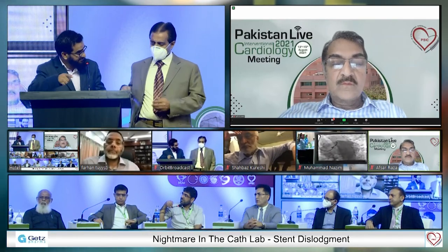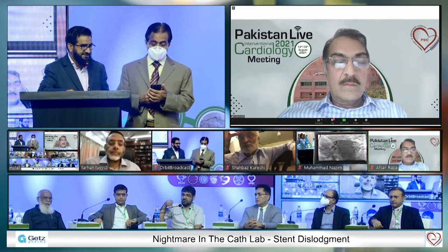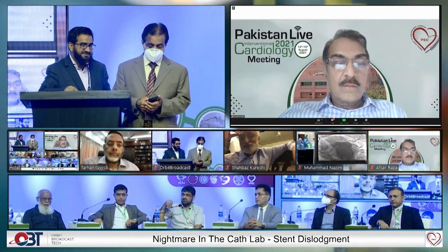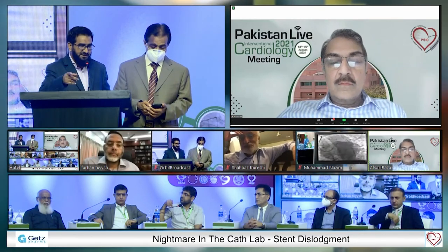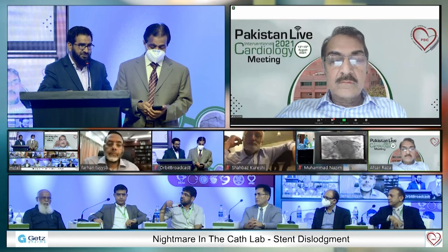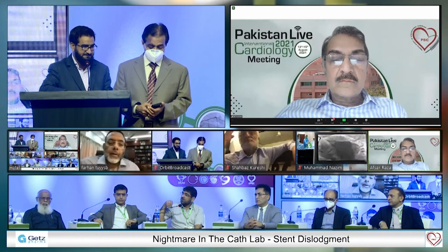I don't know if you saw that technique or not. The other thing is that a coronary micro snare was not available. That's why I used the second technique. Crushing or deploying the stent was the last option on my mind.